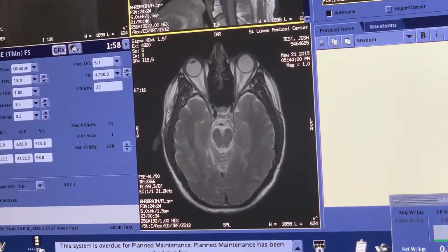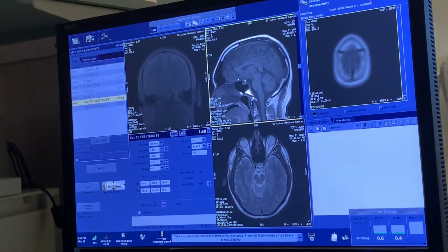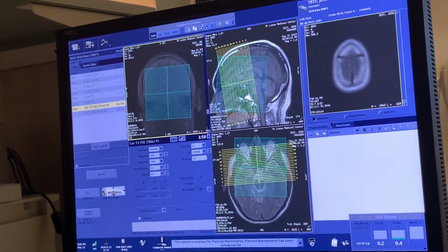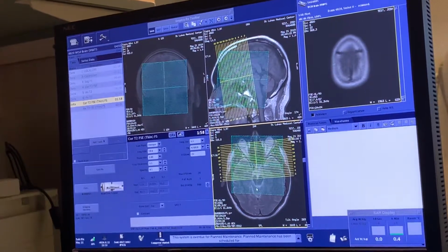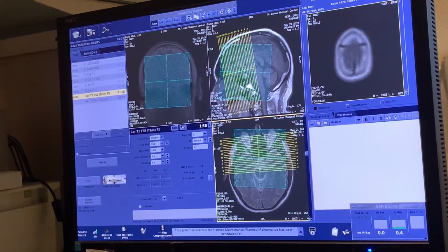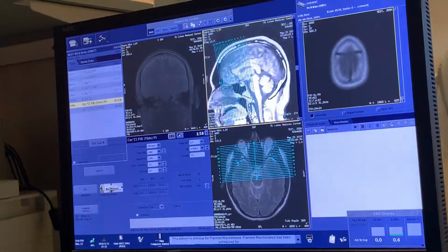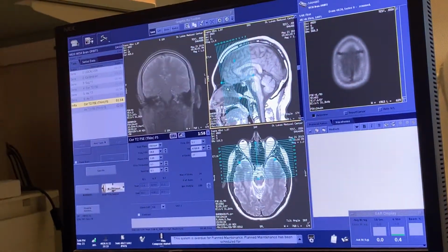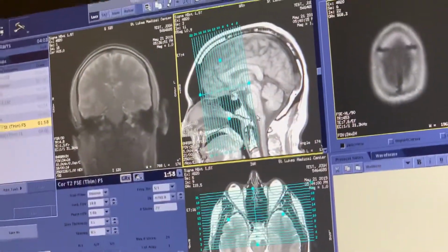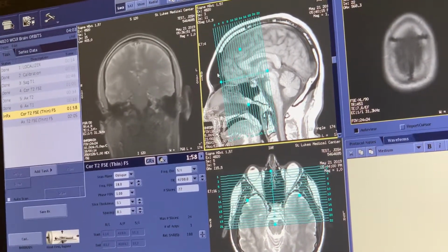So what I'm going to do is, because I'm prescribing a coronal, I'm going to throw down in the sagittal plane. It gives me a shim volume, which I can just basically stick in the anterior of the skull, like the forward half of the skull. This is the area that we're scanning, and I can get rid of it because I hate looking at it. Now that I've thrown down, I want to make sure that I'm scanning the correct plane, which I am. This is a coronal, but unfortunately it's going the wrong way. It's going from posterior to anterior, so I have to hit R to correct that.